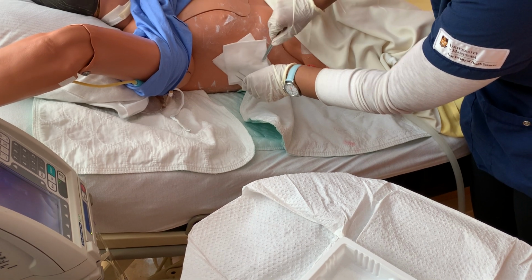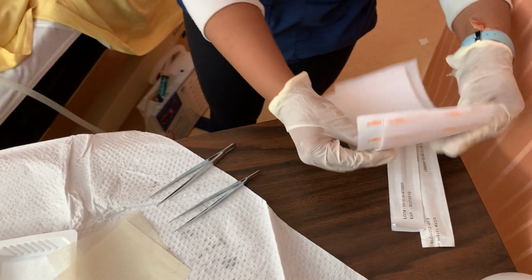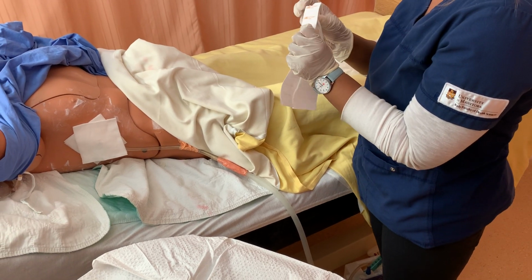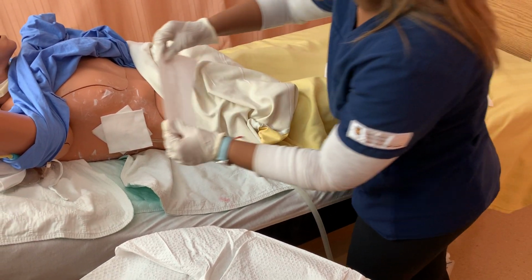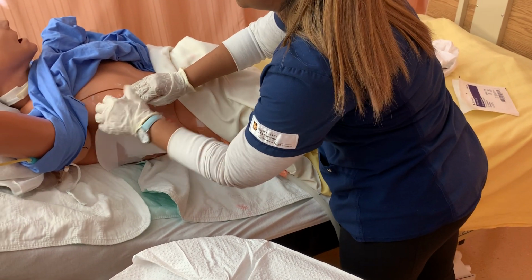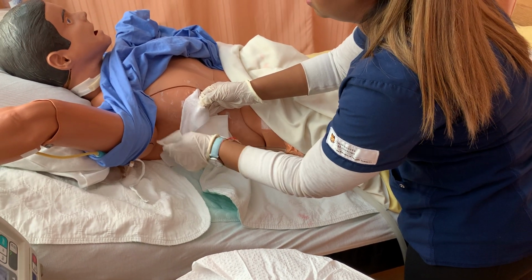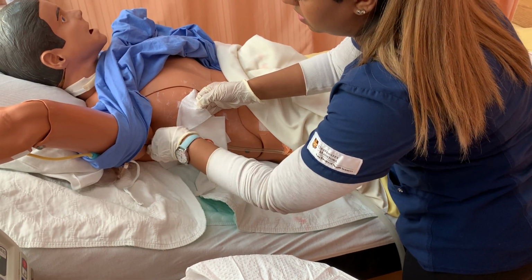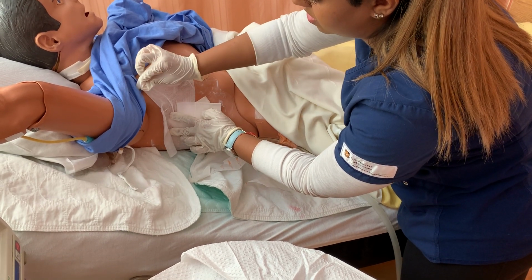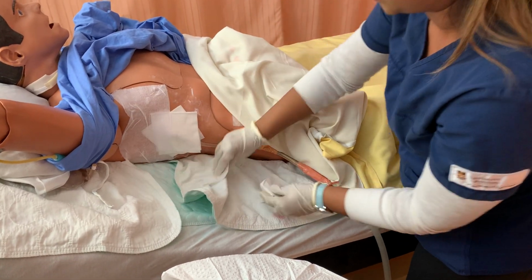You're still doing okay? Good. There we go. I'm just checking the bedside, making sure nothing's. Okay, so I have my Mefix here. This is garbage. And I'm just gonna make sure this is a nice occlusive seal because we don't want anything going in there. Daniel just went by. There we go. Okay. Nice and occlusive there. You can just add a piece of tape there.